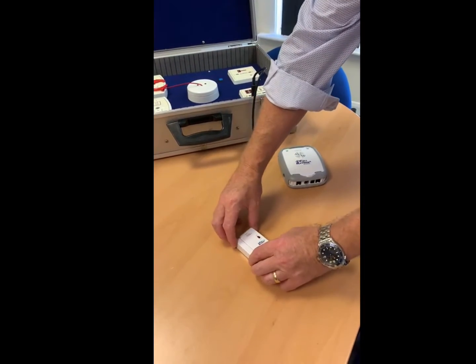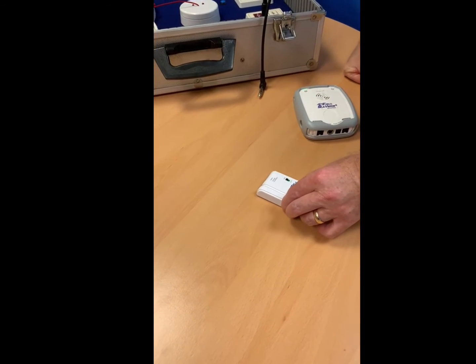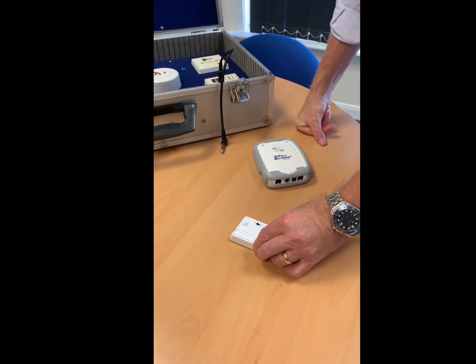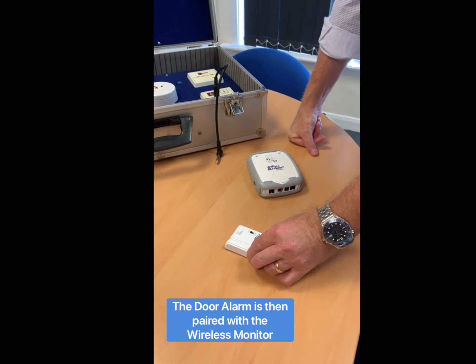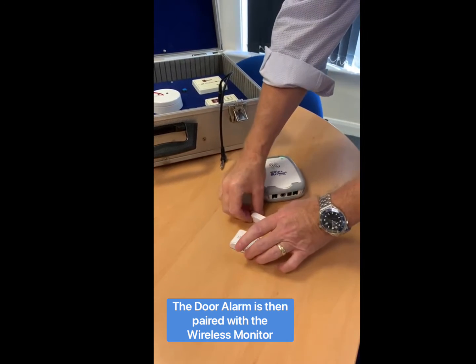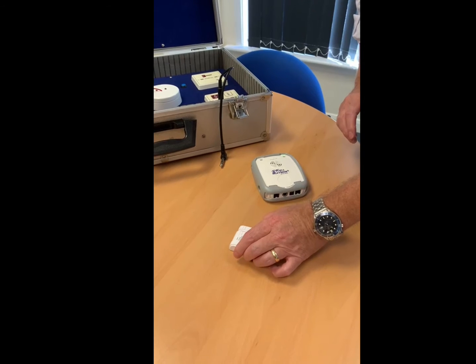So we're going to put the lines over this side and we're going to turn it on. Hopefully this is going to pair with the unit. Once it's paired with the unit, we put this over the other side, and we should get another bleep to say that it is paired.